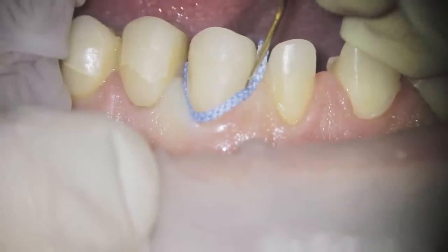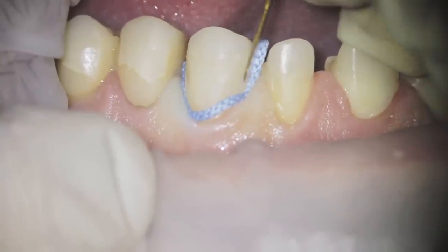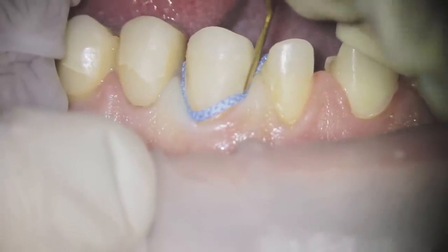The technique I use to place the retraction cord — and which gives me nice results — is to push the retraction cord from the side, with the spatula between the teeth and the retraction cord, pushing and helping the cord slide into the sulcus rather than being pushed down below.